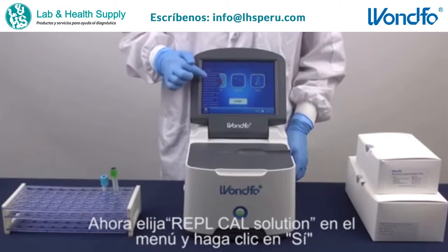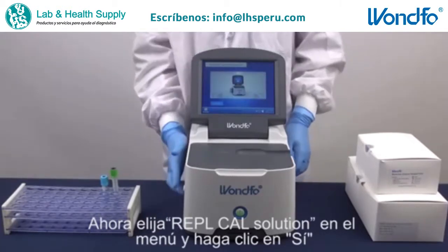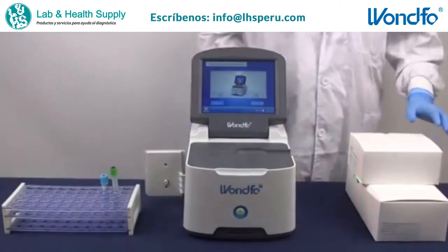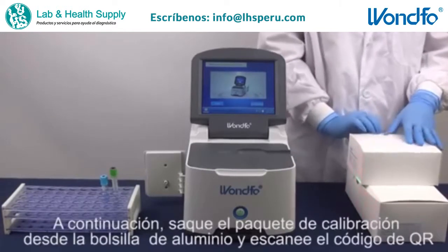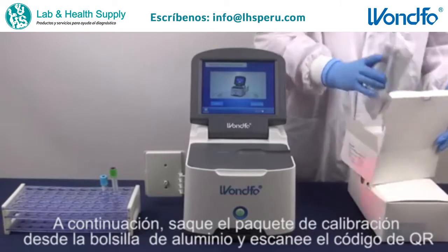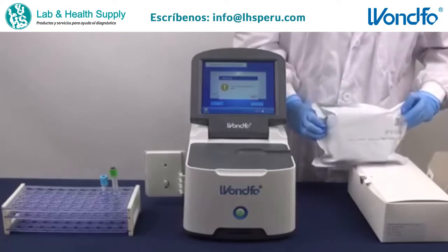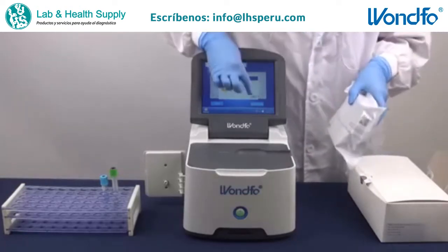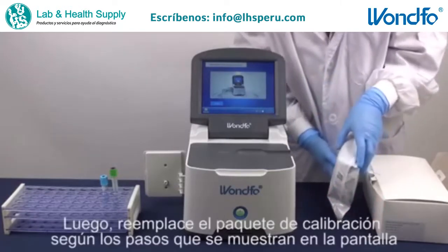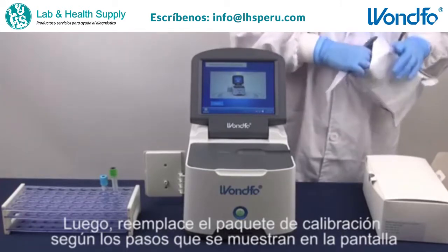Now, choose Replace Calibration Solution from the menu and click Yes. Next, take out the solution from the aluminum foil bag and scan the QR code. Later, replace the calibration solution according to the steps shown on the screen.